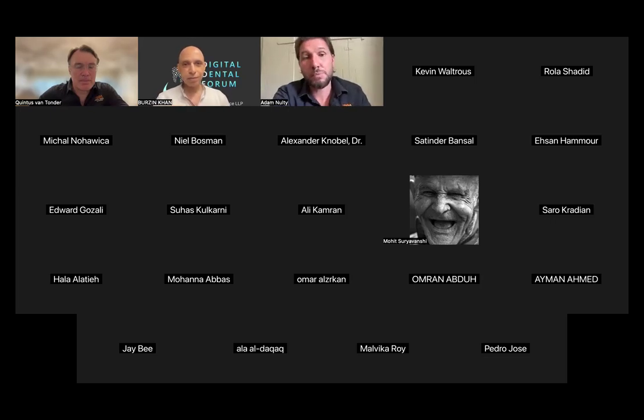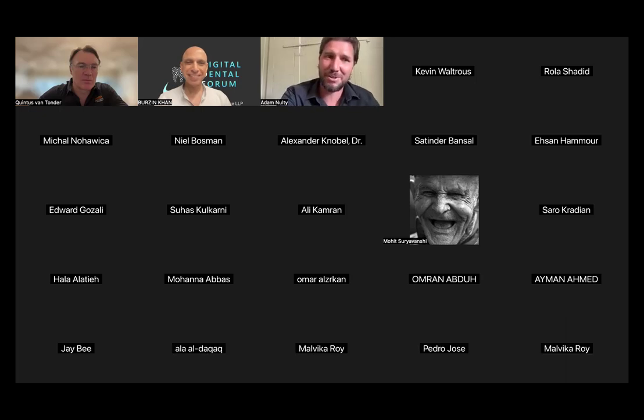And of course, something very useful, which you guys around the world will have that we don't have in the UK, is the ability to use larger CBCT scans, which go right up to the condyle. So you've got the actual patient's face bow to be able to use in your 3D analysis, to combine with the face and set up the perfect virtual articulator in exocad. We don't have that, so I can't tell you about it as much as I'd like to.